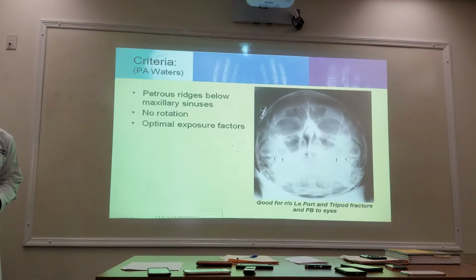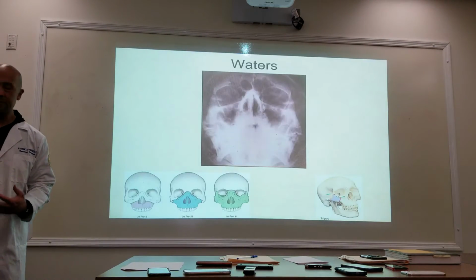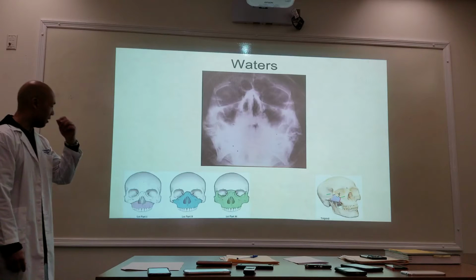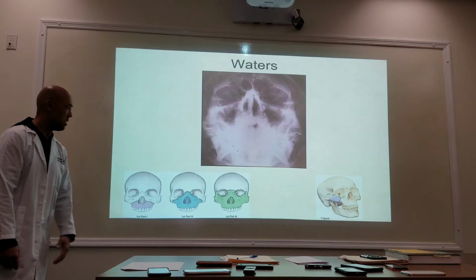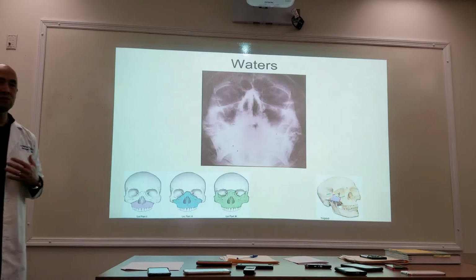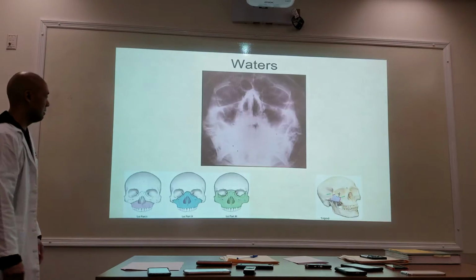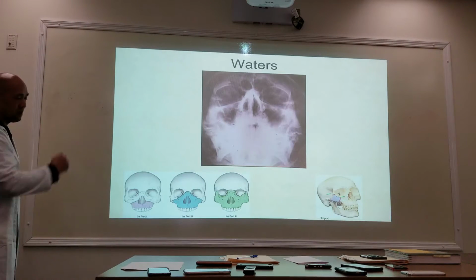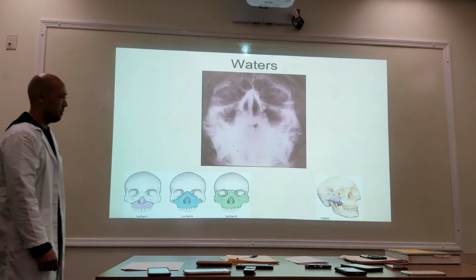Le Fort is basically a horizontal fracture of the maxilla, and they have different categories. You have 1, 2, and 3, 3 being the worst. But again, it's a horizontal fracture involving the maxilla. So the Waters is good for that, and it's also good for the tripod fracture.